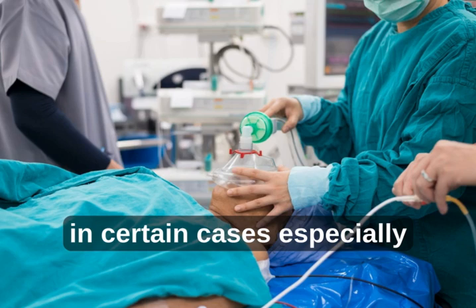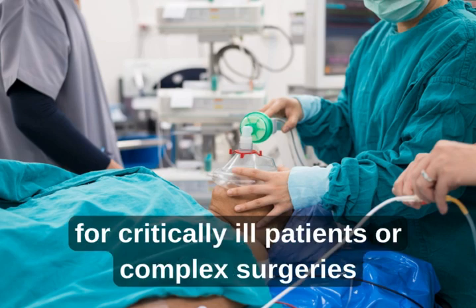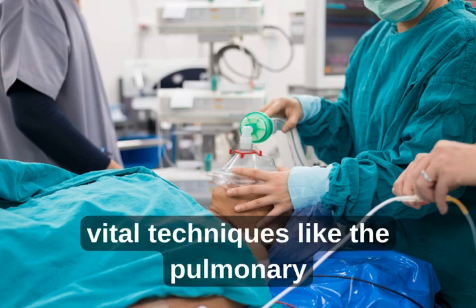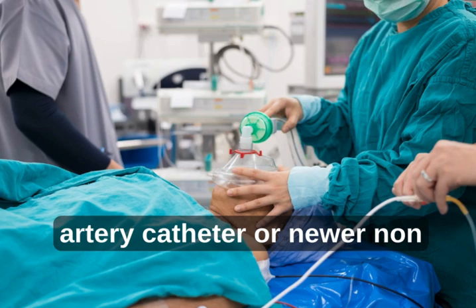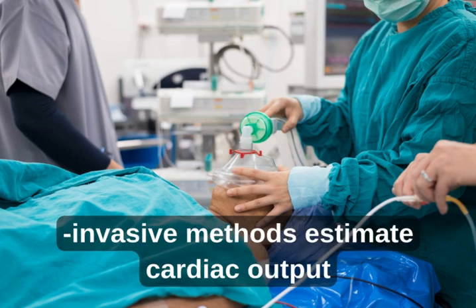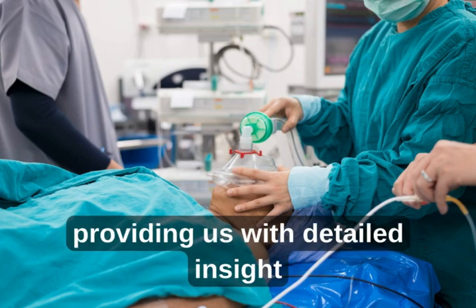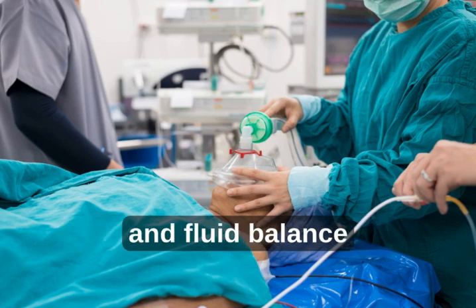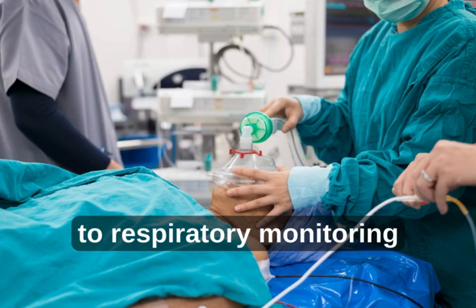In certain cases, especially for critically ill patients or complex surgeries, cardiac output monitoring can be vital. Techniques like the pulmonary artery catheter or newer non-invasive methods estimate cardiac output, providing us with detailed insight into the patient's circulatory efficiency and fluid balance.